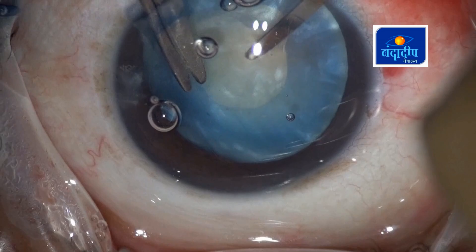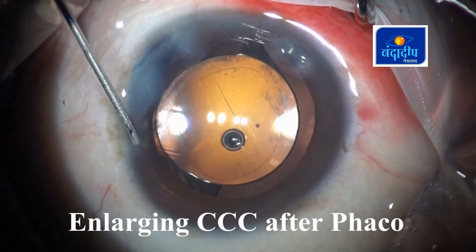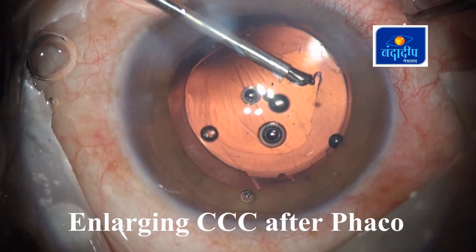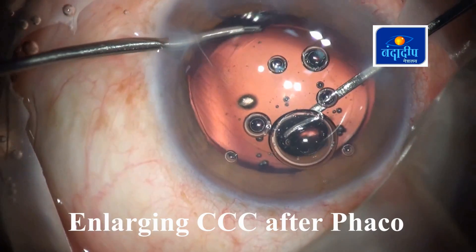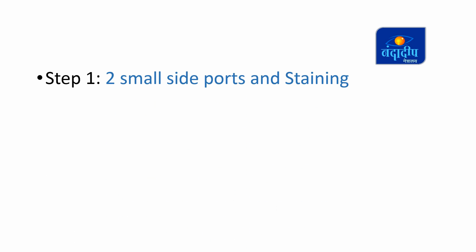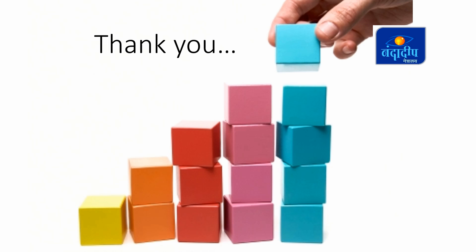Doing CCC at this stage is very easy because there is no intumescence left. In some cases we tend to make a smaller CCC; we can simply give a tangential nick with Vannas scissors and then enlarge the rhexis with microcapsulorhexis forceps. We can do that even after IOL implantation — in that case the IOL optic works like a template. So even if you make a smaller rhexis to start with, we can always modify it later. If one follows all these steps properly and methodically, we can achieve a good rhexis in all cases of intumescent cataracts, and there is no need to avoid premium IOLs in such cases. Thank you so much for your patient listening.